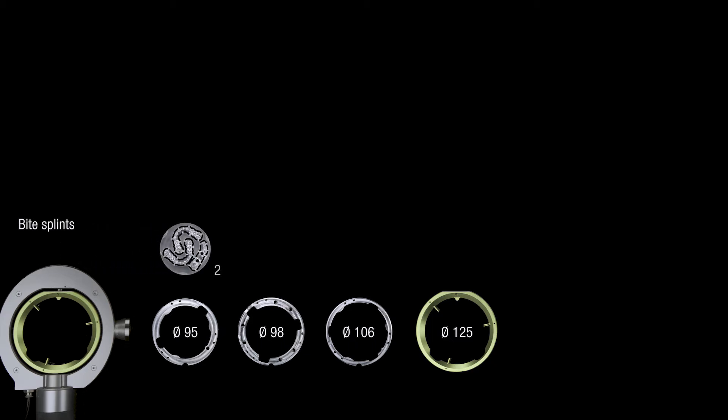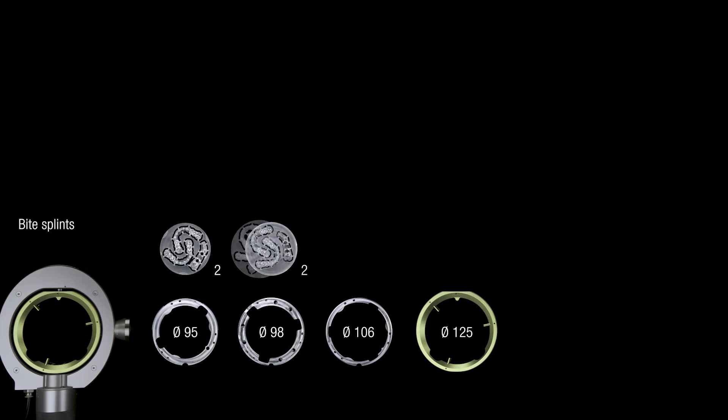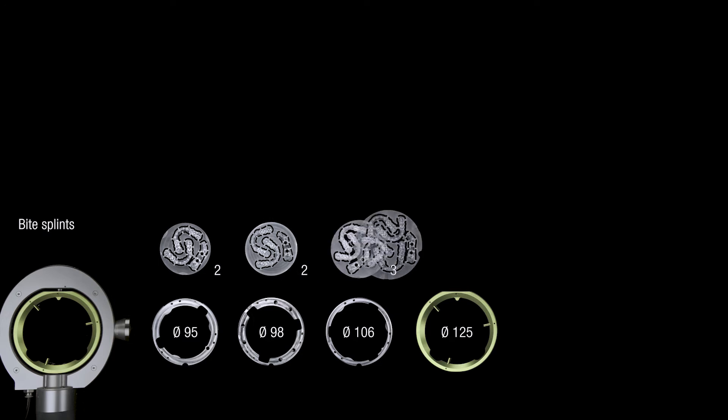This means that oversized bridges, which would not fit in normal blanks, can be positioned and milled without any problems.